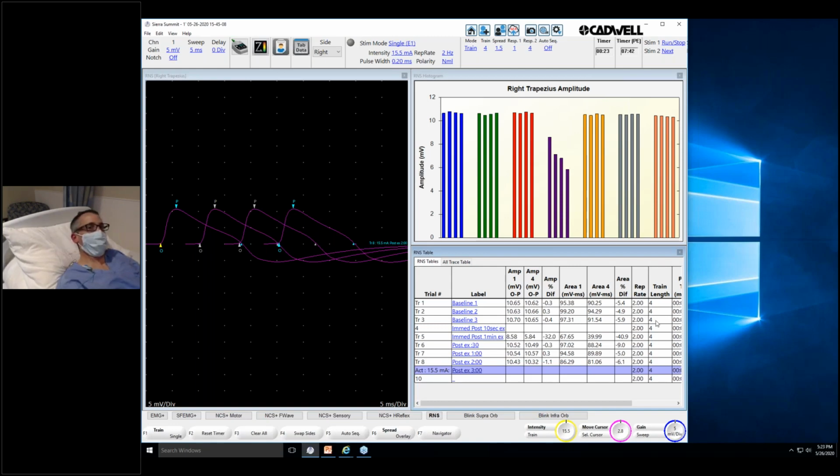So that's the spinal accessory. That's a good nerve to learn to do repetitive nerve stimulation. It's a proximal nerve. It's going to be a higher yield in myasthenia gravis than the ulnar. And it's technically tough, but not that tough. It doesn't require a lot of stimulus.